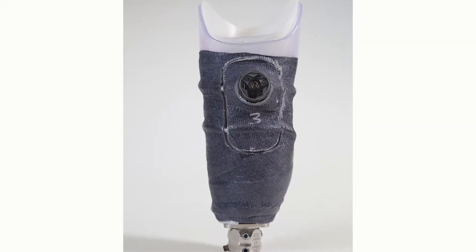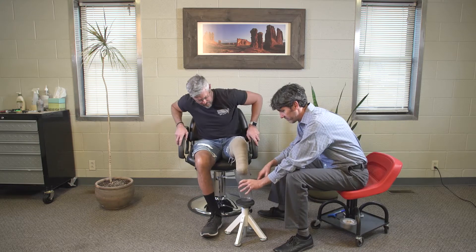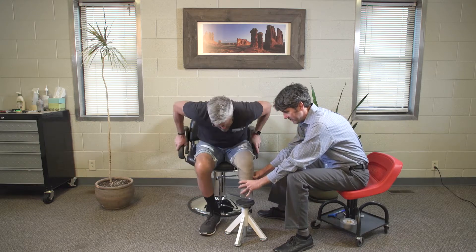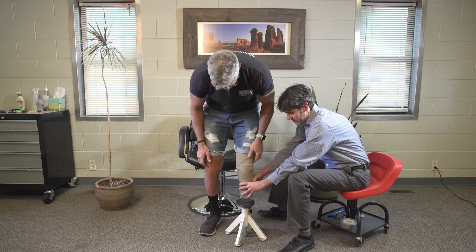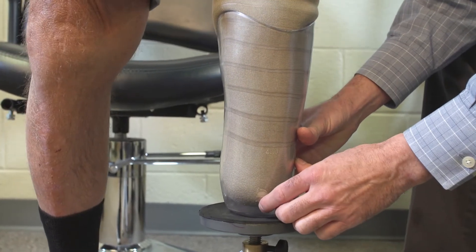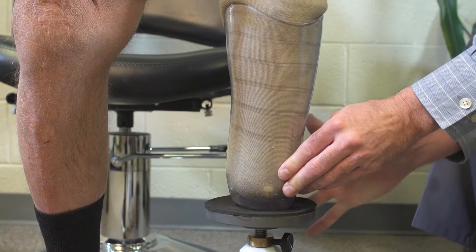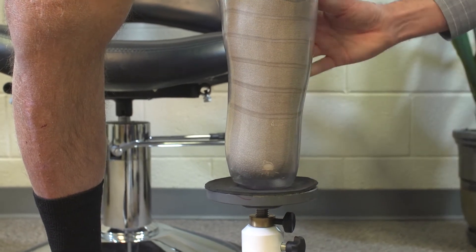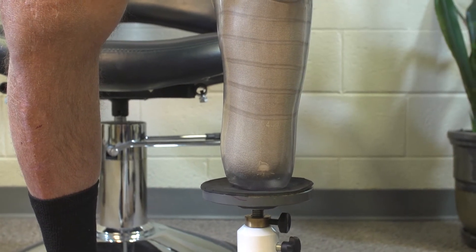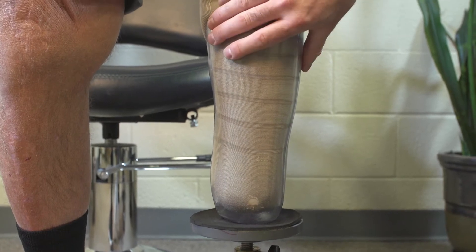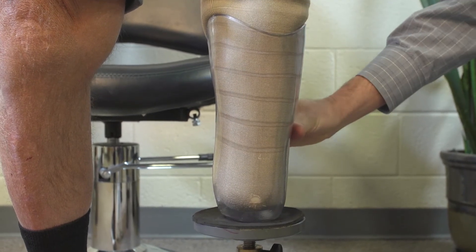Making a RevoFit check socket is simple. Make your first check socket verifying fit and volume as always. If you nailed the fit on the first check socket, simply add RevoFit adjustability to it. If, however, changes are needed, fabricate a second check socket, and then integrate RevoFit to this one.